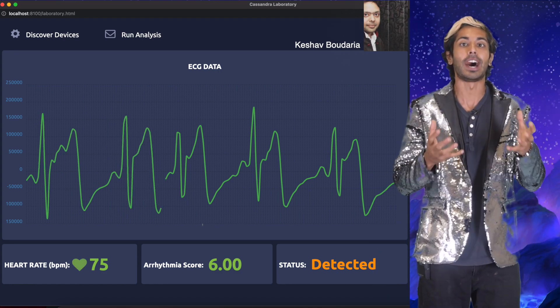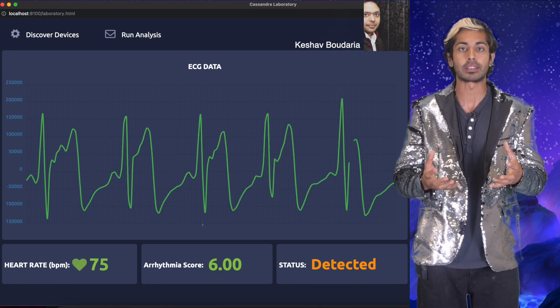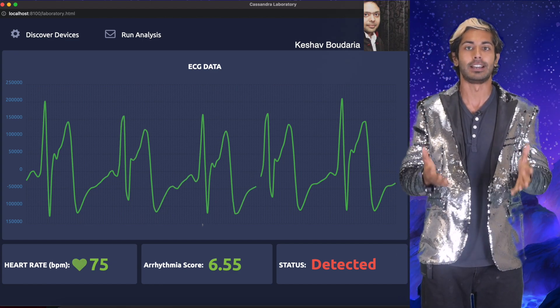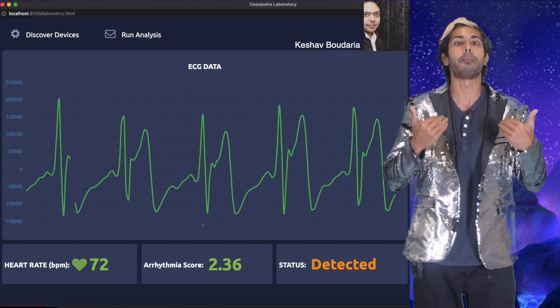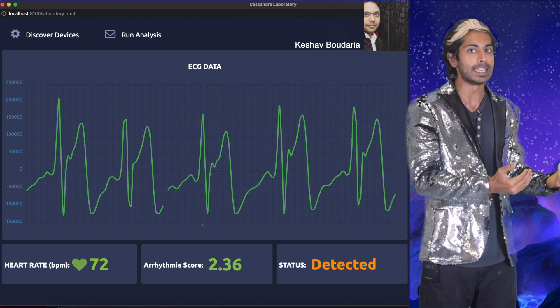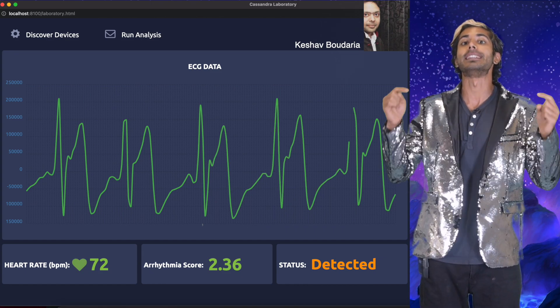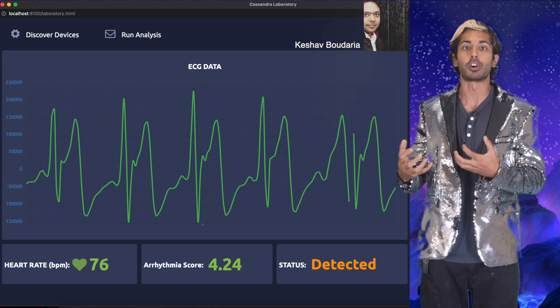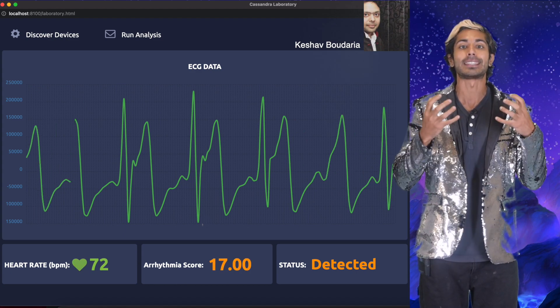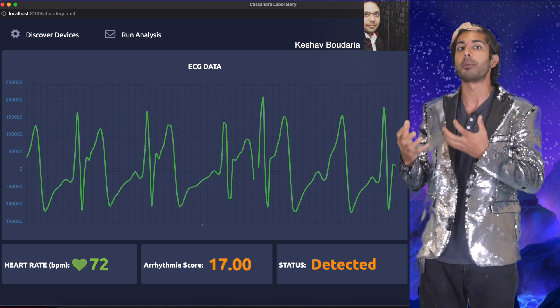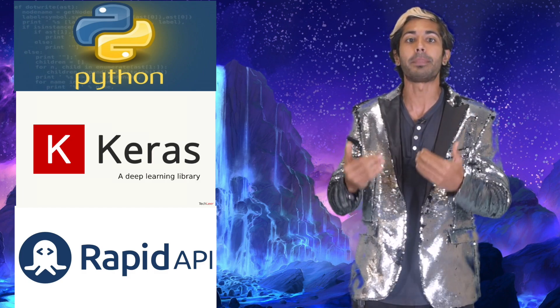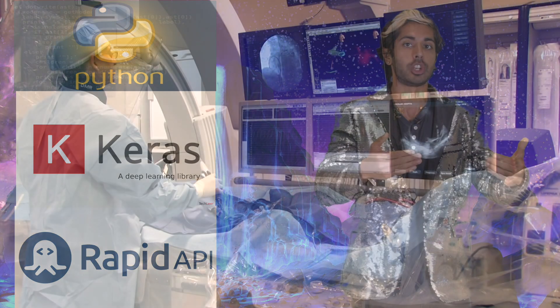This is a real-time demo of a healthcare project codenamed AlphaCare that Keshav Baudaria and I have been working on for the past few weeks, and I'm open sourcing it today. It's built entirely with Python and uses deep learning to detect abnormalities in a patient's heartbeat signal. We'll also use a tool called Rapid API to easily look up and display more symptom information.